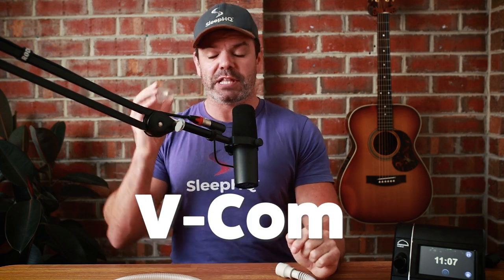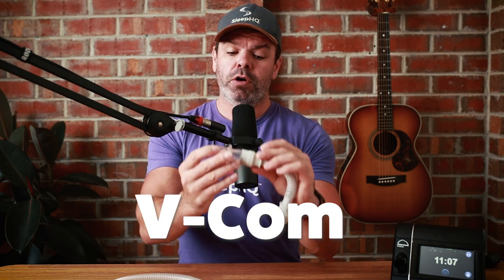G'day mates, if you're a beginner and you're just starting out on your CPAP journey but you're finding therapy a bit challenging — as most do — here's an affordable comfort accessory that makes sleeping with CPAP easier, quieter and more enjoyable. It's called a VECOM by Sleep Res, and you place your VECOM between your CPAP tube and your mask.